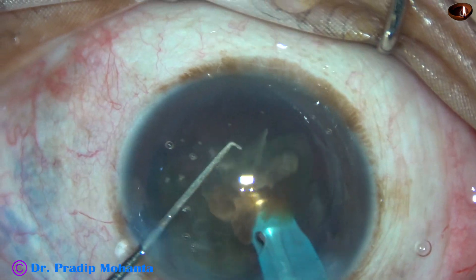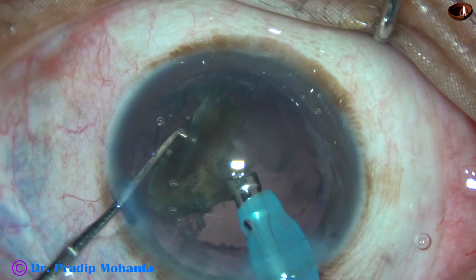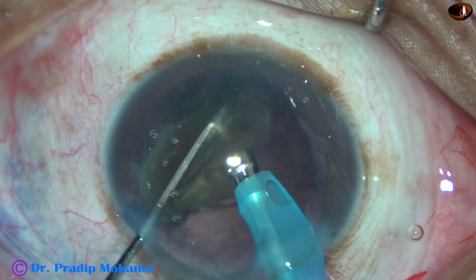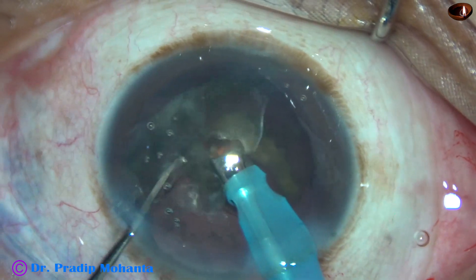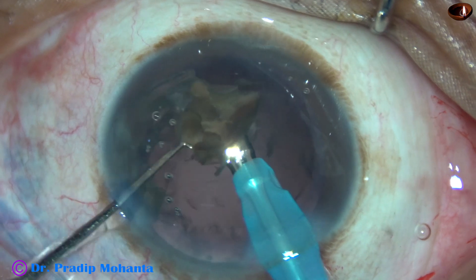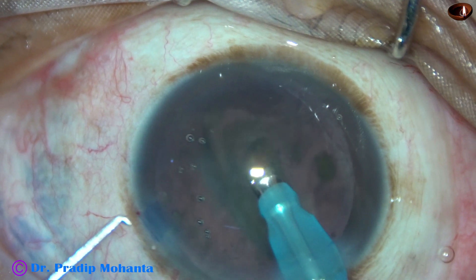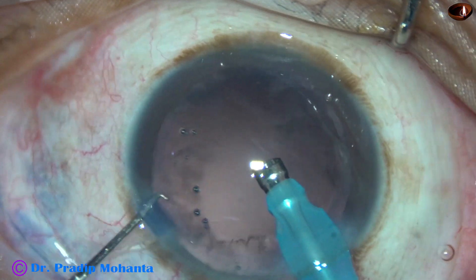The cornea remains very clear the next day. All the pieces are emulsified with high vacuum, high flow, and high energy: 90% ultrasonic energy, 45 ml per minute flow rate, and vacuum of 450 mmHg. During emulsification of the last piece, we can reduce the vacuum — coming to sculpt mode where vacuum is only 50 to 60 mmHg — but in this case it was not necessary.